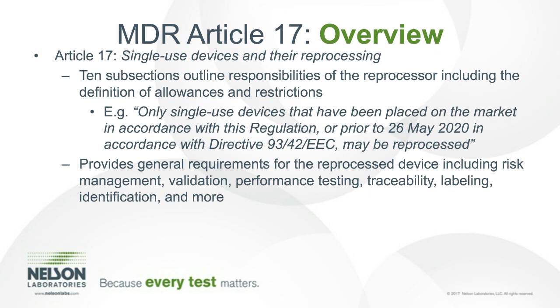Other clauses, such as 3, allow exclusions or exceptions from certain rulings, providing that the reprocessor is performing in accordance with common specifications, detailing requirements concerning such matters as risk management, the validation of processes and procedures, product release and performance testing, a solid quality management system, reporting incidents involving devices that have been reprocessed, and lastly, the traceability of the reprocessed device.